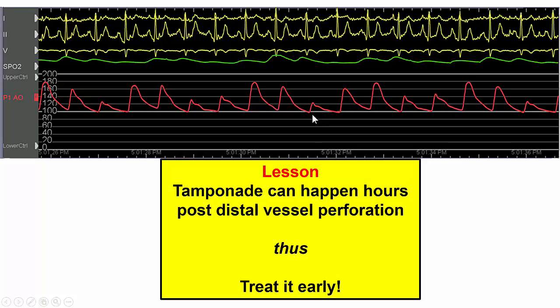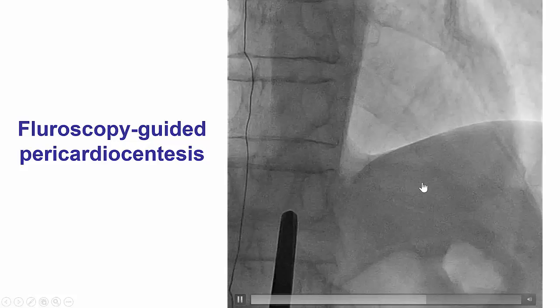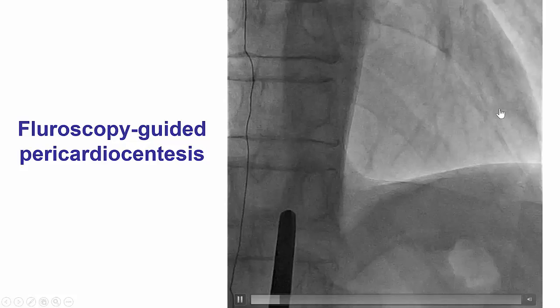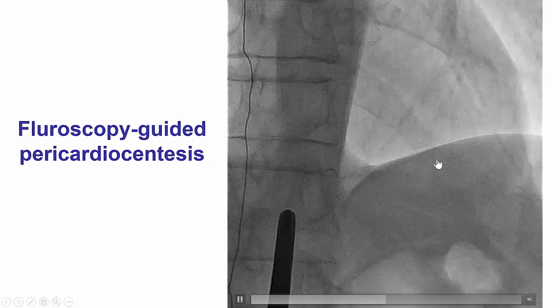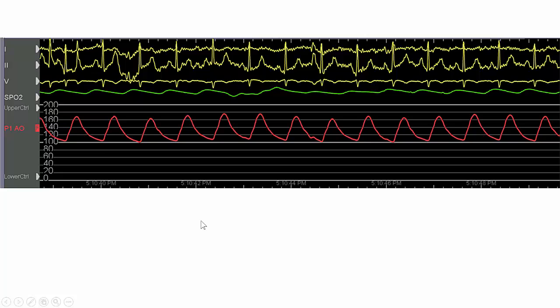This can be a particular problem if it happens in the middle of the night when there is limited staff to take the patient back to the cath lab. In this case, pericardiocentesis was performed. One aspect of pericardiocentesis in perforation is that X-ray can provide guidance — we can see a double shadow, with contrast in the pericardial effusion, so one can have a target for where to perform pericardiocentesis. A wire is inserted into the pericardium, the effusion is drained, and the patient's pulsus paradoxus resolved with blood pressure now looking great.